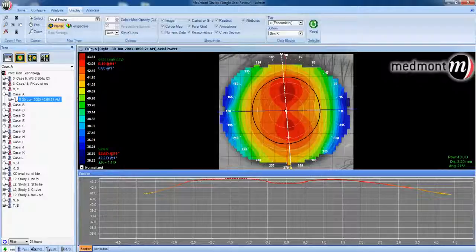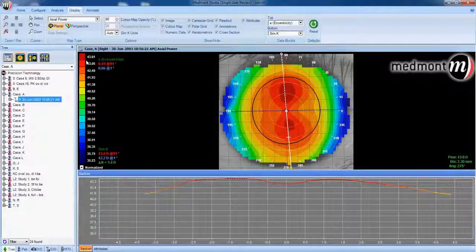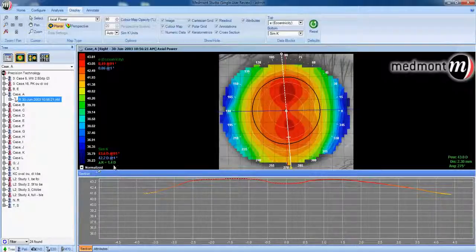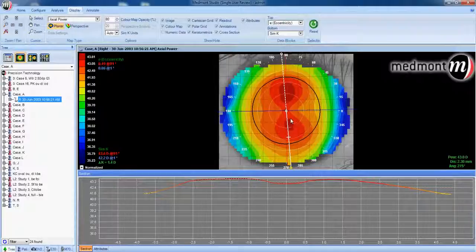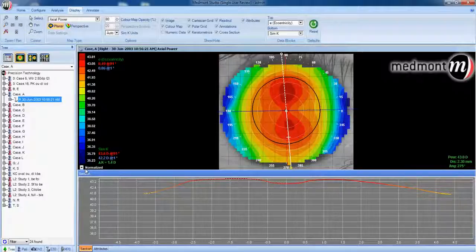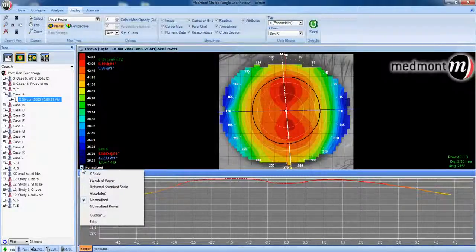Next, we could look at the scale range along the left-hand side. Notice the topographer shows the flattest it can read is 35.23 diopters and the steepest it can read is 43.61 diopters. The scale is set to a normalized scale range, meaning the topographer will show from the steepest to the flattest that can be read on the selected maps. If you select a topography with much steeper or greater range of curvature, the scale will adjust for each individual patient eye. Normalized scale is the best way to interpret maps to get the best definition on each individual eye. You can also click on the down arrow and select from any one of the absolute scales.